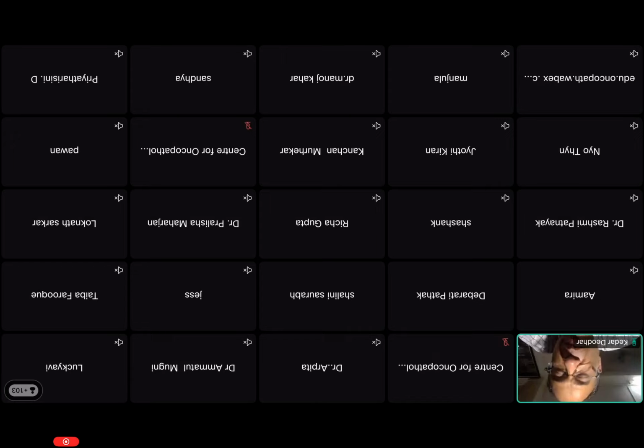Also, the difficulty will come if they are very few in number, then you would want to do a Giemsa or some other stain to prove that they are there. Sometimes the patient may have taken partial treatment, and that's when you will see fewer in number. So in that case, it's better to use a special stain of your choice. But if you say they are seen on H&E, I will not debate with you. They can be seen, and it is fine to report that.